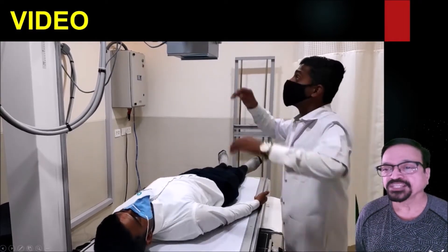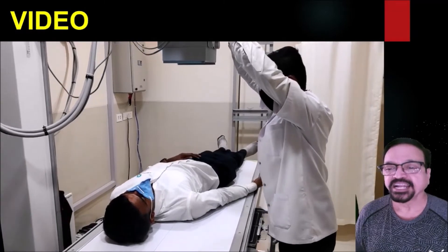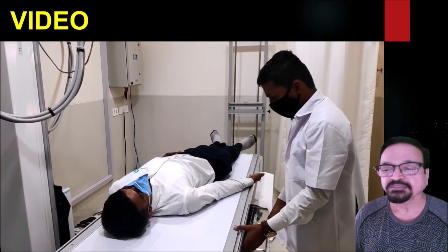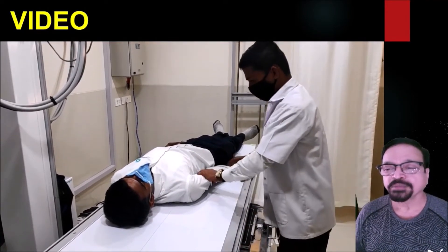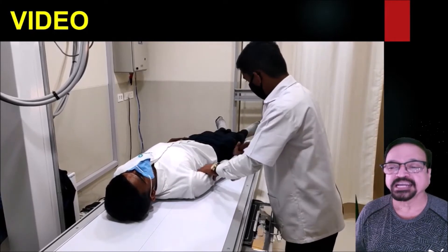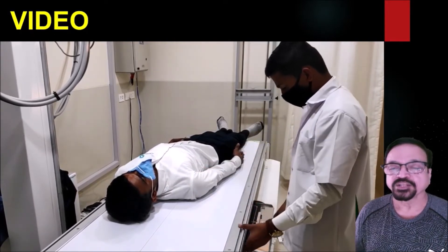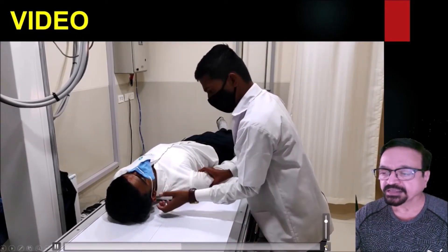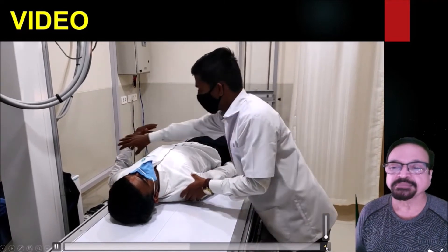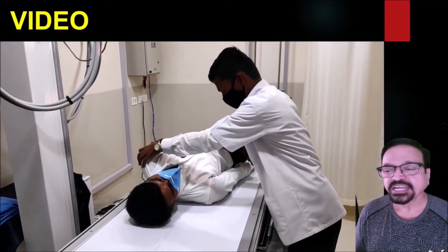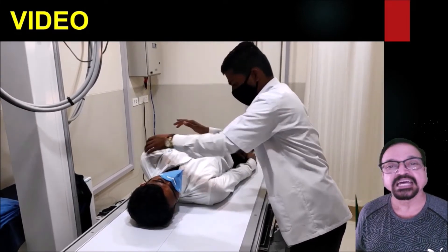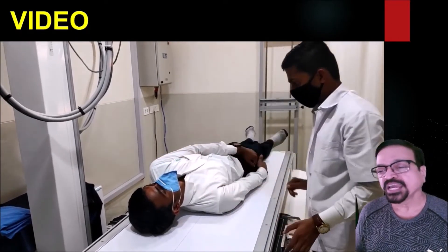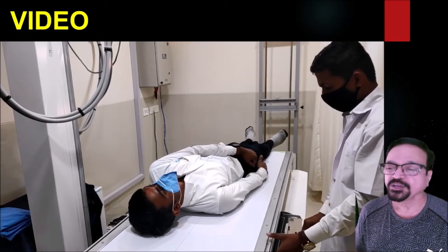Here you have to position the patient below the central ray. Centering is very easy — you can feel the acromion process. Note the hand position and the neck position. The thumb has to be up so that it is in a neutral position. Proper instructions should be given to the patient, and the technician should check whether the patient is experiencing any pain while taking the radiograph. The opposite shoulder is elevated — this can be done by the patient holding the edge of the table, or if they can remain stable on their own that is also fine, otherwise a sandbag may be used.